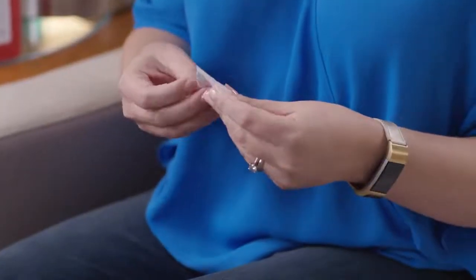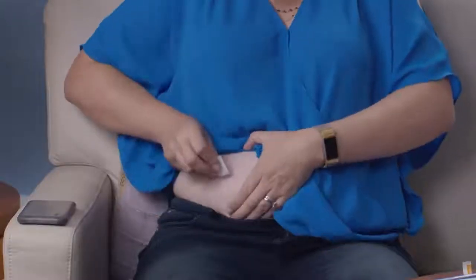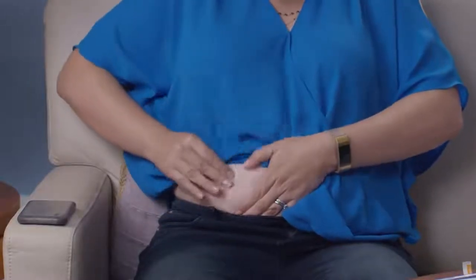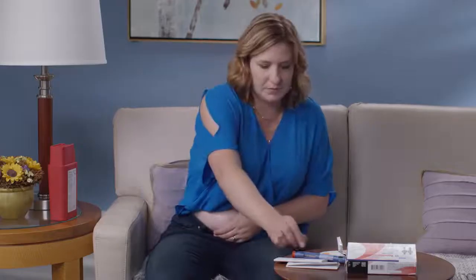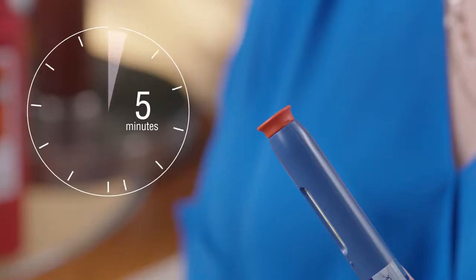I like to give the injection in my stomach. The first thing you need to do is clean the injection site with an alcohol pad. Then, when you're ready to inject, take the cap off. Remember that after you take off the cap, you have to give the injection within five minutes. If you don't, the needle may dry out and the injection may not be successful.